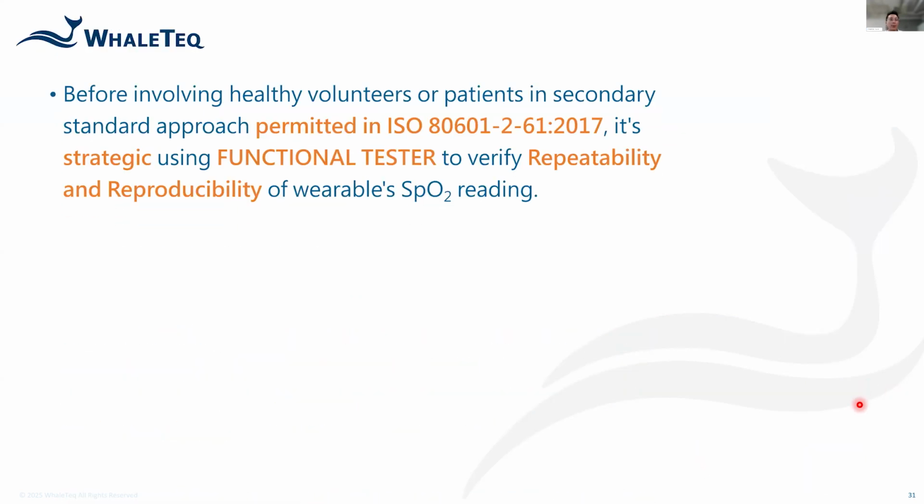So overall, we would like to wrap up our webinar today by mentioning that the standard does give us a way out before we have to go through the clinical investigation, which is costly and time-consuming. An optical simulator is the example of the functional test mentioned in the standard.